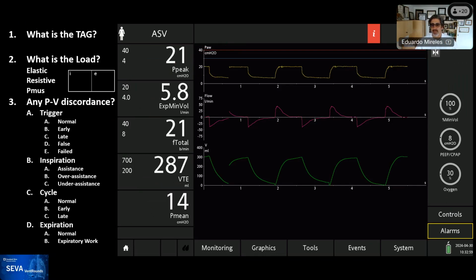There we go. Great. So I start seeing very good, Raquel and Victor, Ariel, obviously. So it's pressure control, and it's IMV type 3 OI. And so let's dissect this tag for a second.